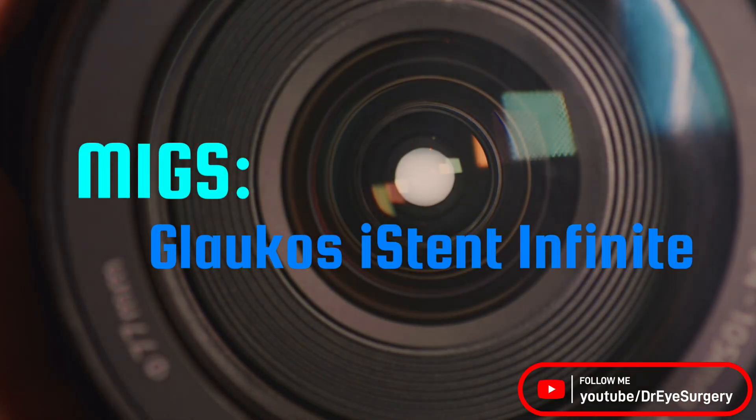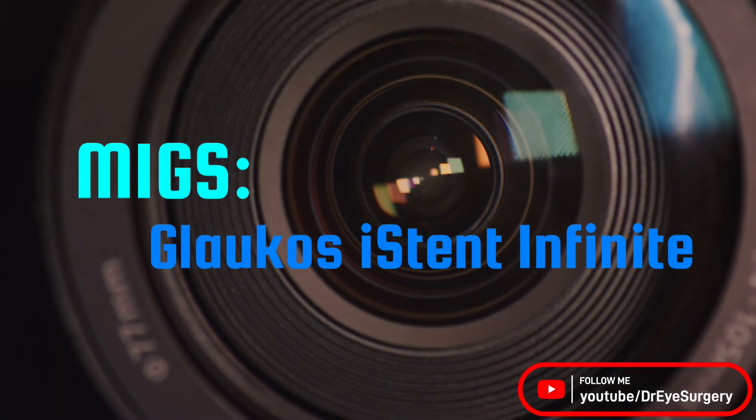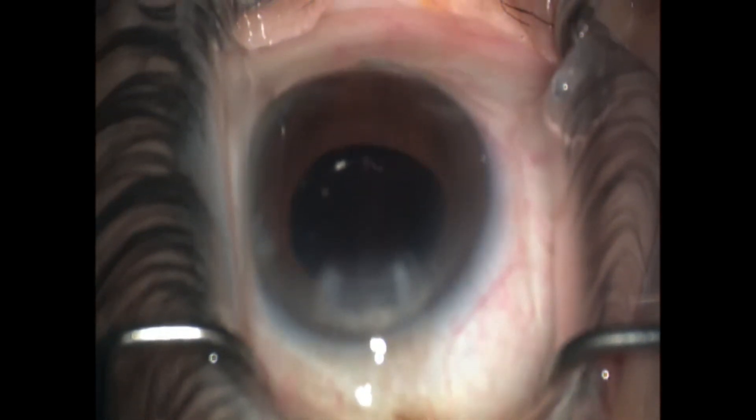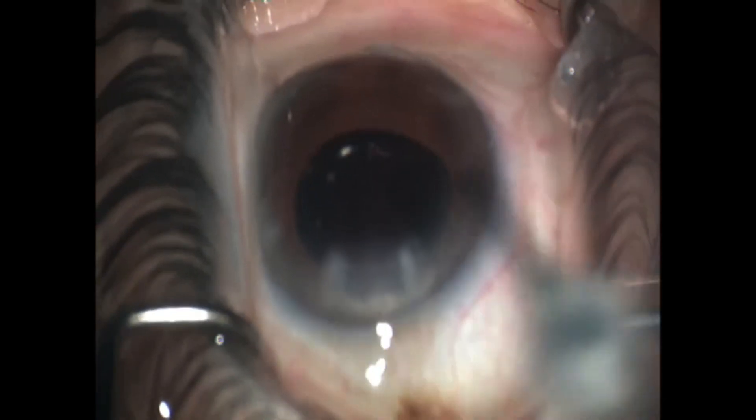This is a demonstration of the new iStent Infinite. The new handpiece for the iStent — you're going to see here in a moment — this is that new injector handpiece. It actually has a sleeve built onto it, so you no longer have to retract the needle to expose the trocars.